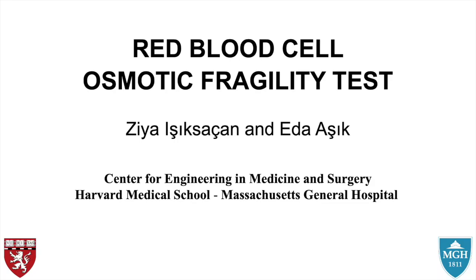Hello, my name is Isiksacan. I'm a postdoctoral fellow at Harvard Medical School and Massachusetts General Hospital. Together with my colleague Eda Aşık, we have prepared this video describing the red blood cell osmotic fragility test.